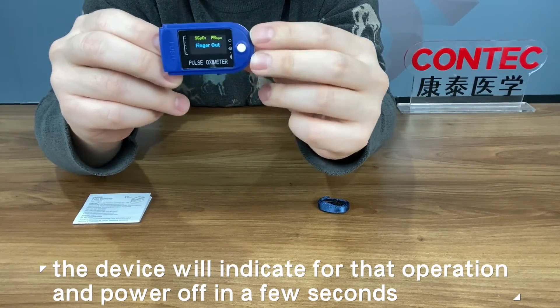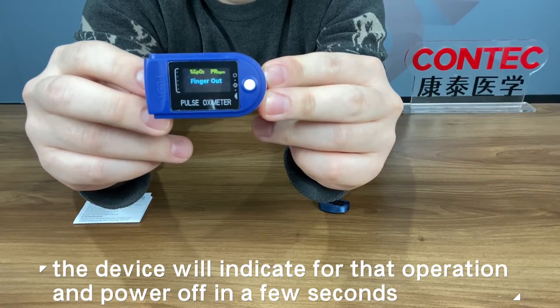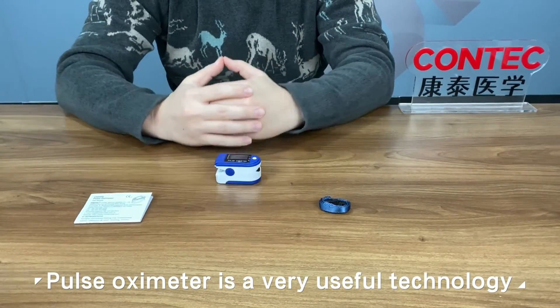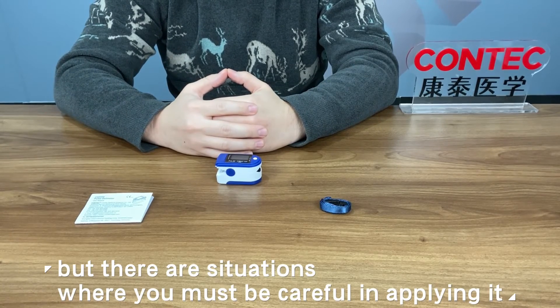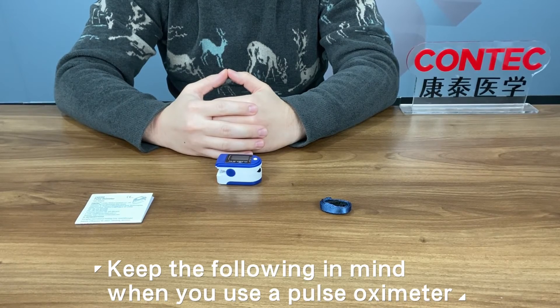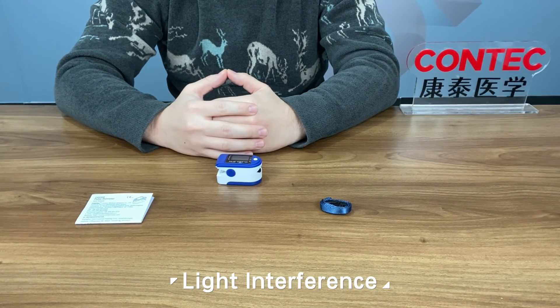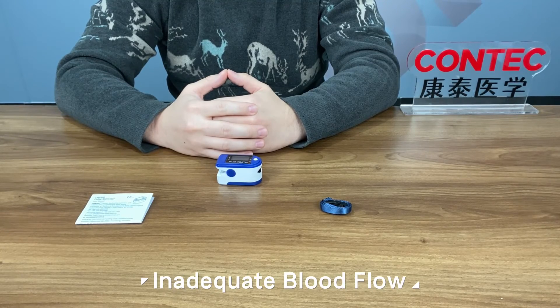Remove the finger. The device will indicate that operation and power off in a few seconds. Pulse oximeter is a very useful technology, but there are situations where you must be careful in applying it. Keep the following in mind when you use a pulse oximeter: light interference, movement artifacts, inadequate blood flow, nail polish, and more.